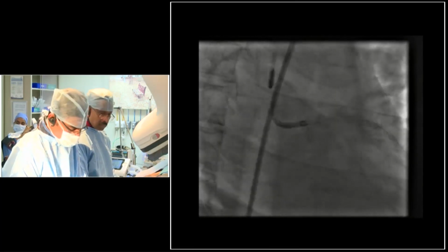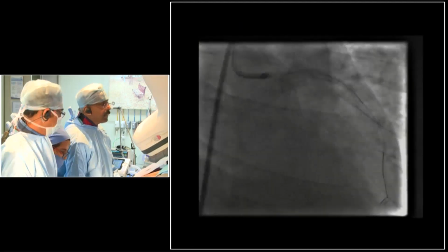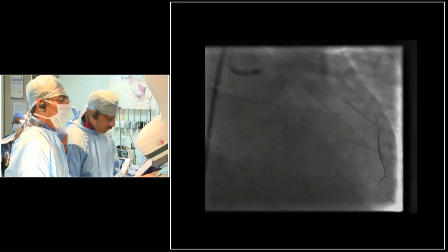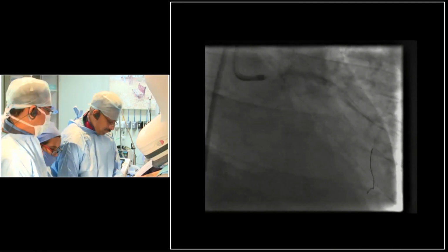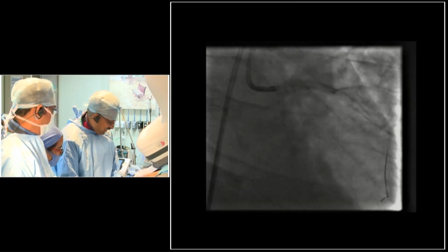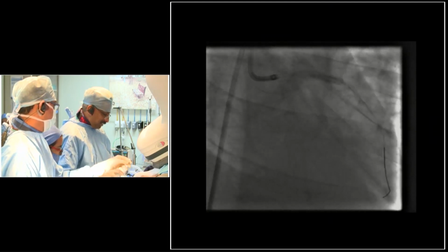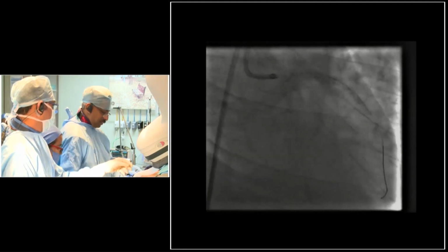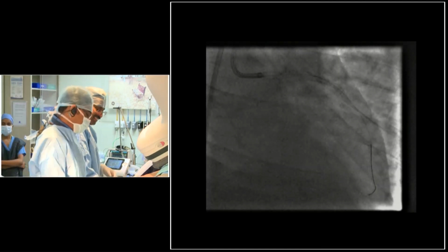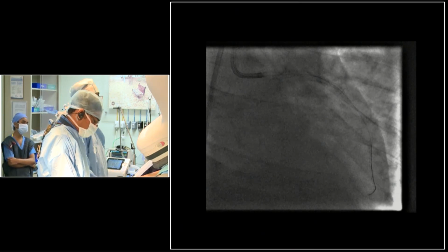If at all Impella is available here at a reasonable cost, Dr. Ajit and Dr. Vijay, sir, would you have used it instead of IABP? I know Dr. Ajit Mullasari, sir, is an avid believer of studies, trials, evidence. So having said that, CRISP AMI and IABP-SHOCK showed no evidence. On the one hand, we believe culprit shock. On the other hand, we don't believe IABP shock and CRISP AMI. How do you take it, sir?